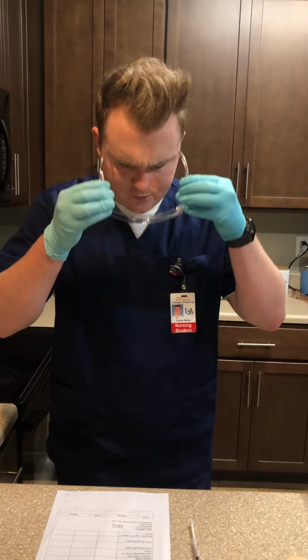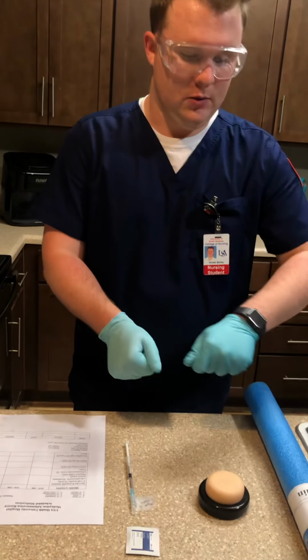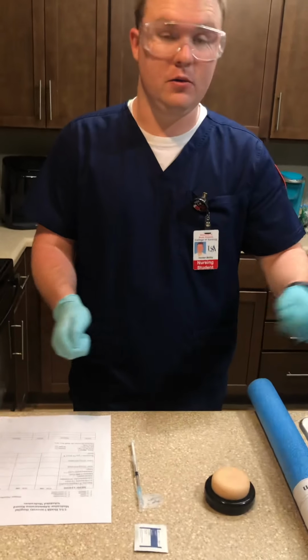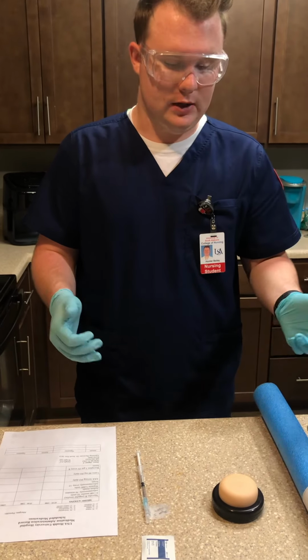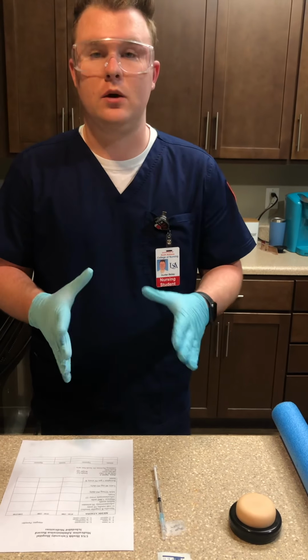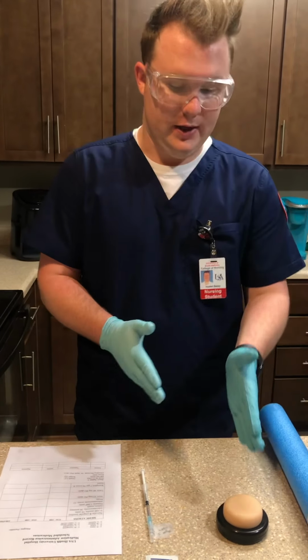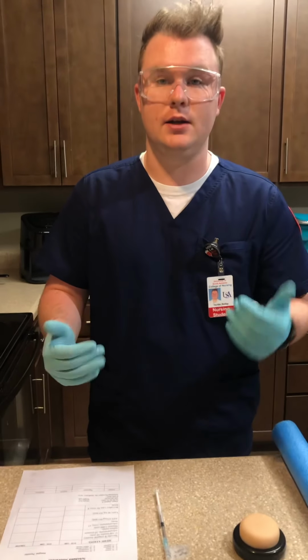Okay, so now what I'm going to do is I want to go ahead and assess for comfort, and I'm going to go ahead and move his gown over his stomach because I'm going to be giving it in the abdomen. So now what I want to do is I want to find the correct injection site. So I'm going to be giving his subcutaneous injection in his abdomen.